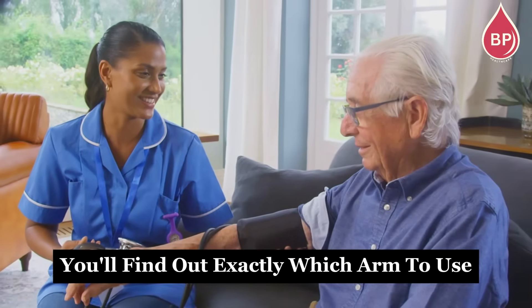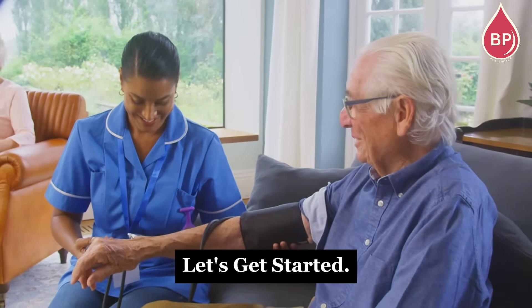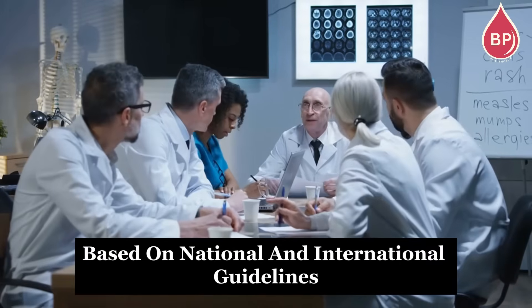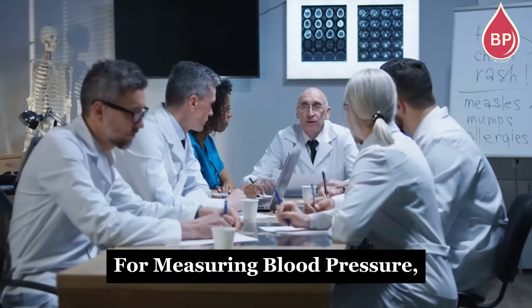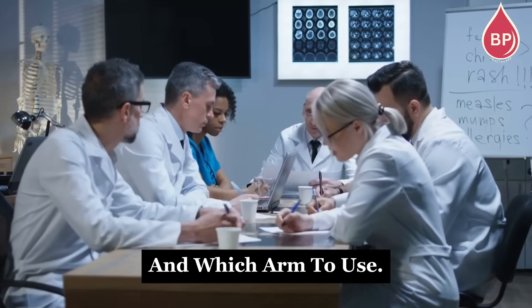In this video, you'll find out exactly which arm to use when measuring your blood pressure. Here are some tips based on national and international guidelines for measuring blood pressure, including the best position for an accurate reading and which arm to use.